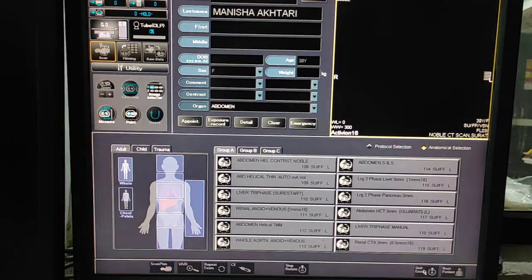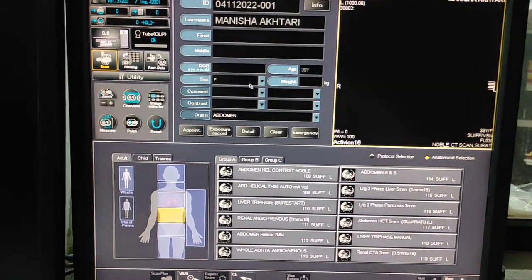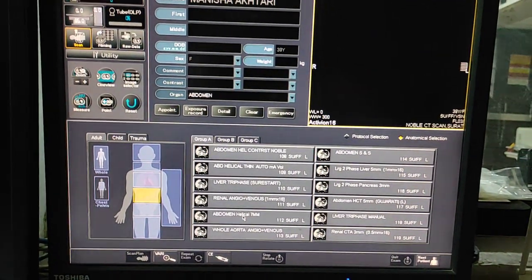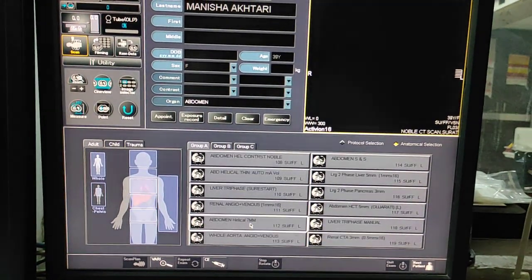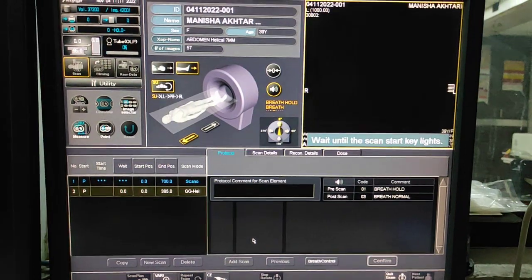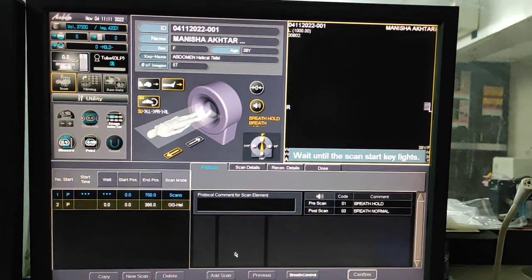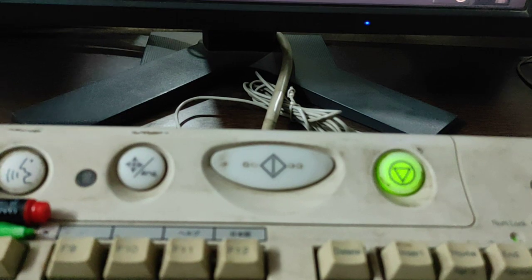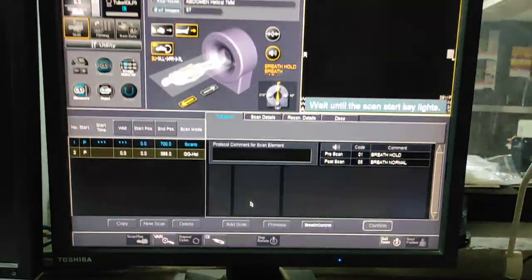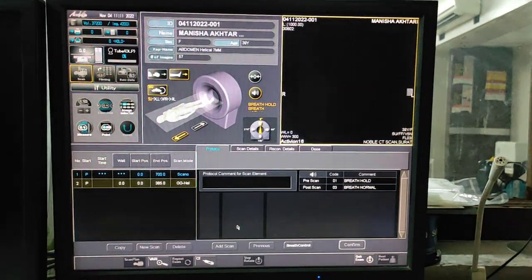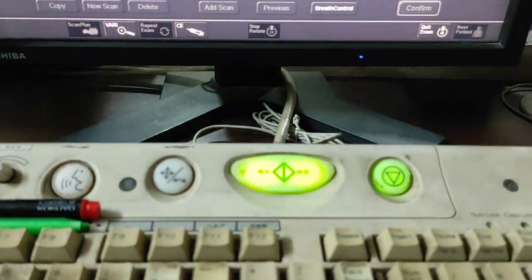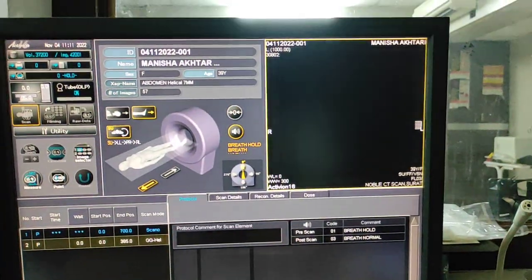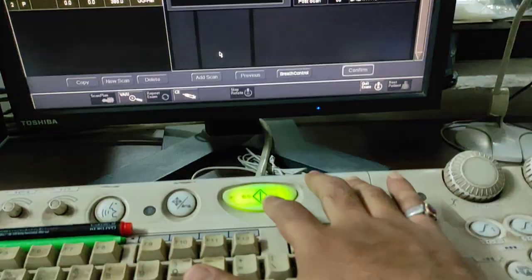After filling the patient data, you have to select the protocol and click on it. Now wait until the scan start key lights up. Once the key lights, you have to press it — press it two times, the second time to confirm.